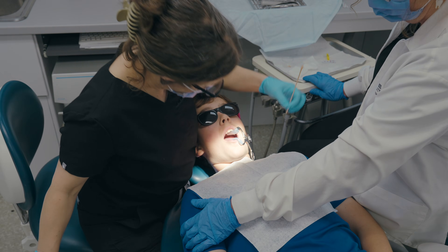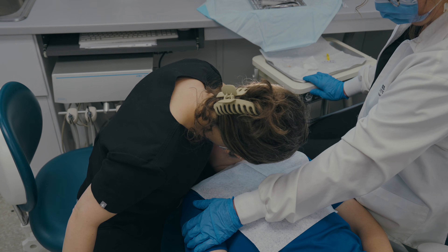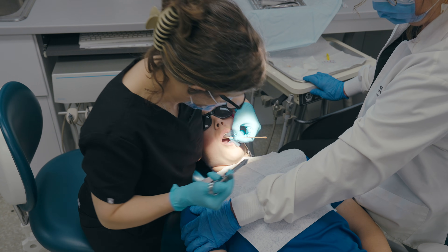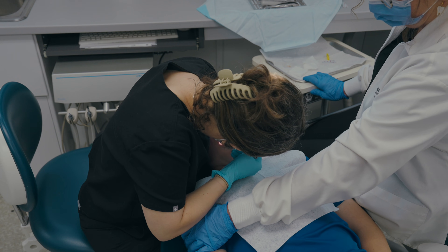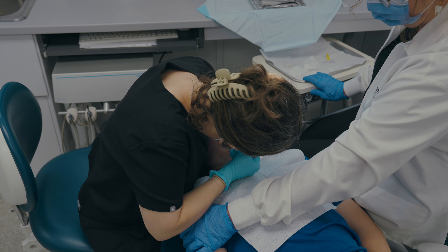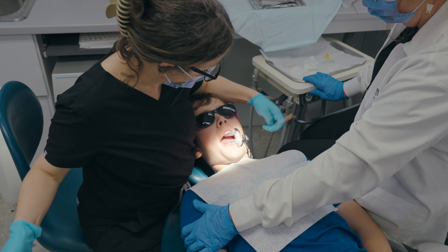For infiltration, the patient's head is stabilized against the operator's body and the maxilla is held firmly in position by the operator. The opposite end of a Q-tip can be used to apply pressure before a palatal or greater palatine injection to desensitize the area.